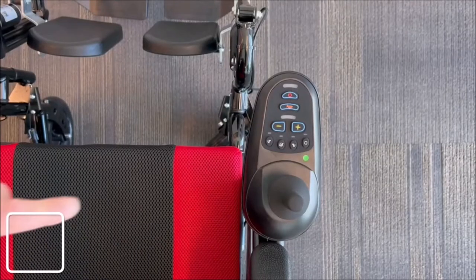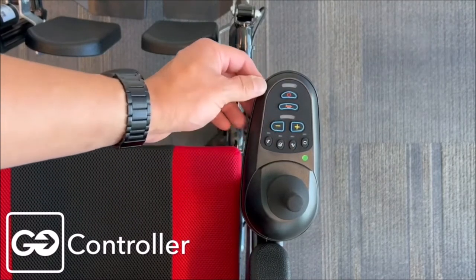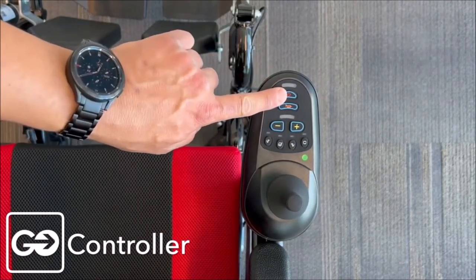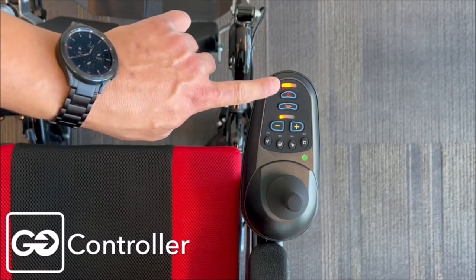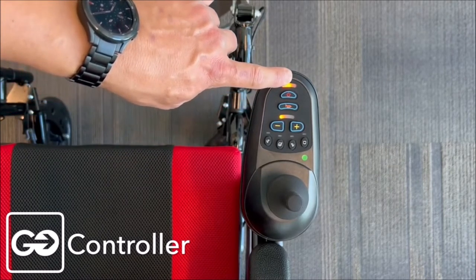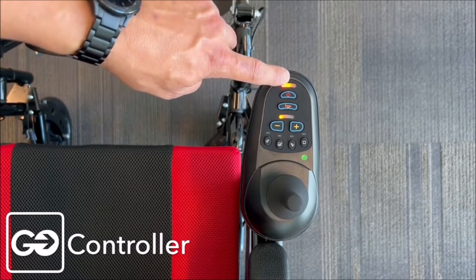Remember, with your motors in the lock position, we can now start using our joystick. We have a lot of controls here and we'll explain these to you as well. Here's our power button — if we turn this on, you're going to see some lights come on. This is a battery indicator light; it shows we have about a half-range battery indicated by the orange light.